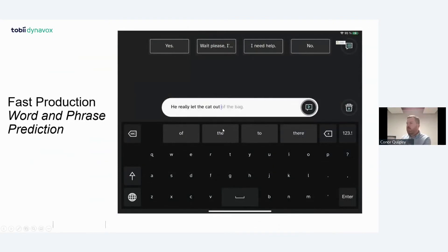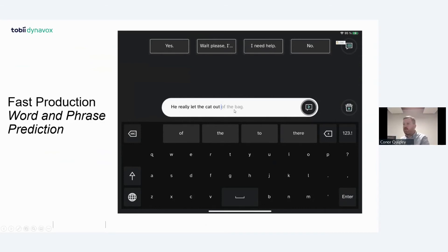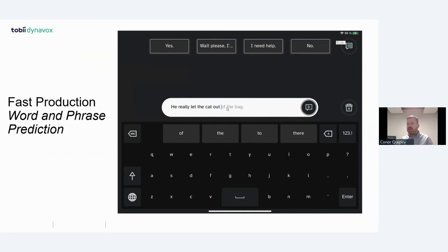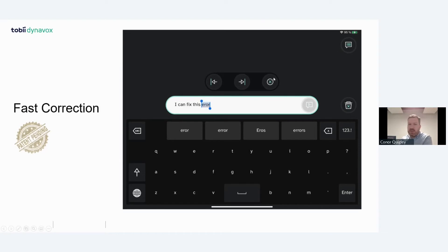The system learns how you communicate — it records your phrases in the background. As soon as you start typing something, it finds from your history and pops it up into the message bar; you look at it and it speaks. So you don't have to do a page jump for phrase prediction. For example, if you often say 'my favorite movie is The Godfather,' as soon as you start typing 'my favorite,' it might predict the rest. There's also fast correction: you can look at any word in the message window and edit just that word, rather than deleting everything after an error.